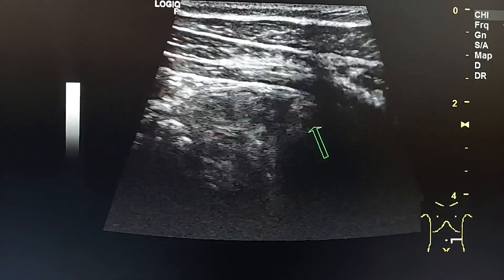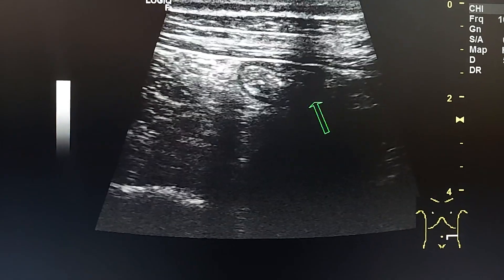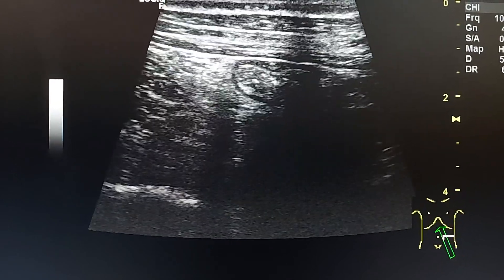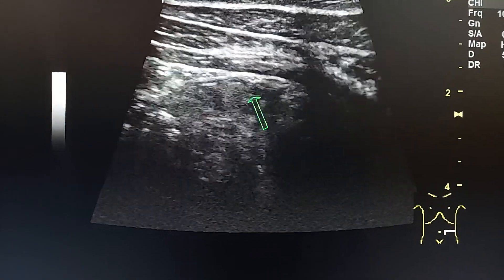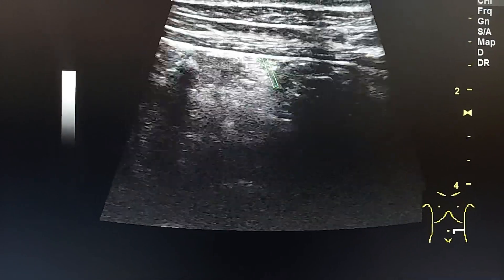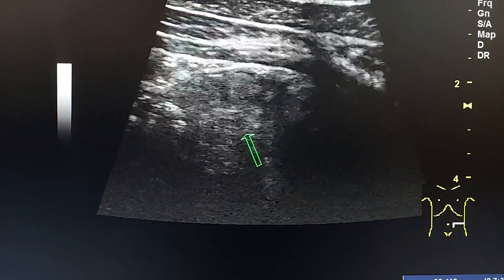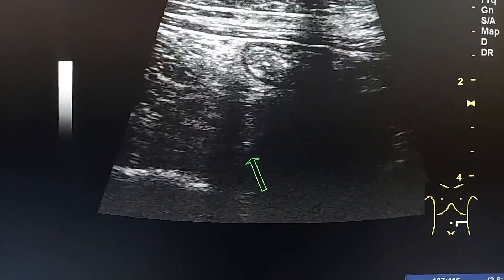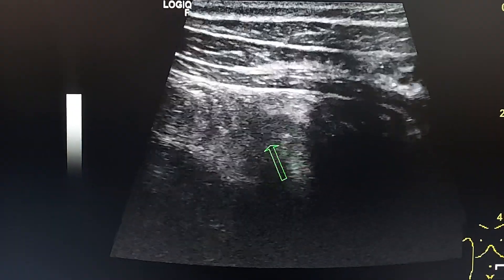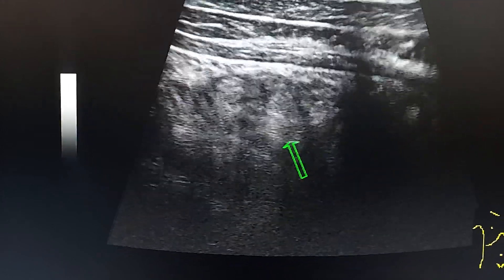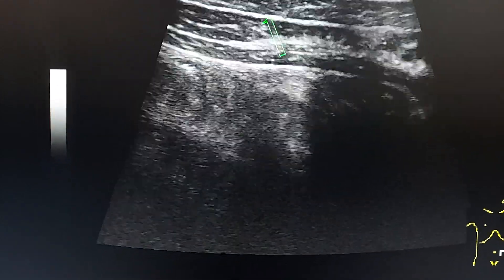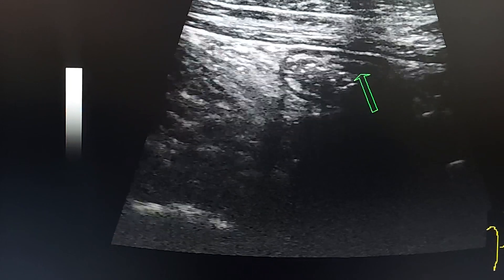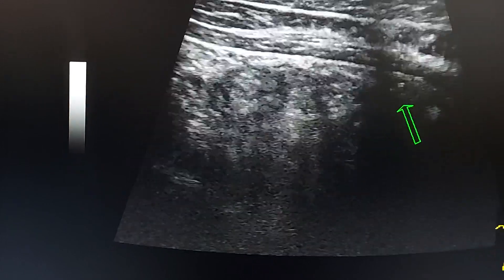We can identify the descending colon by pushing on the abdominal wall on the left side of the abdomen, displacing the small bowel loops from between the abdominal wall and the posterior structures — the psoas and the iliac muscle. Here we see that the small bowel loops are displaced from the field of view, from between the anterior abdominal wall and the psoas muscle, while the descending colon stays in its location because it is retroperitoneal.